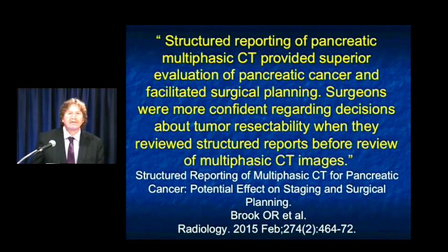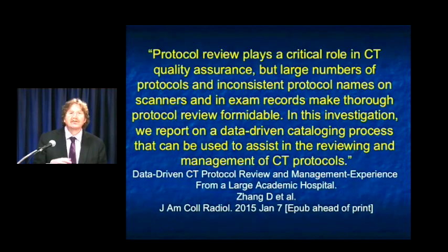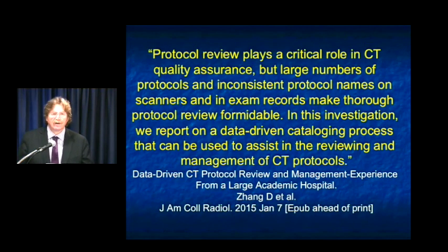Another article recently talked about structured reporting in pancreatic cancer, that surgeons were more confident regarding decisions about tumor resectability when they reviewed structured reports before review of multiphasic CT images. That surgeons had sufficient information for surgical planning in 96%, 69%, and 98% of structured reports, and only 31%, 43%, and 25% of non-structured reports. And they liked it better. So perhaps structured reporting will come along.